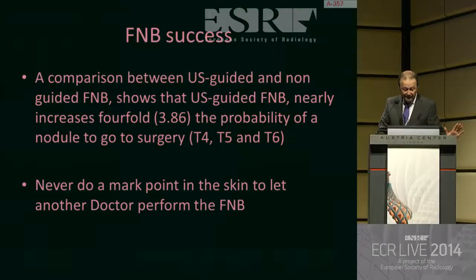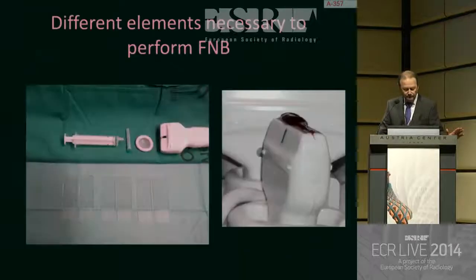We have seen that when the procedures are done by the radiologists, the probability of a nodule going to surgery is multiplied by 4. So it's very important to put the needle in the most suspicious nodule, in the correct part of that nodule: the solid, vascularized, peripheral portion, avoiding cystic spaces. Never do a mark point in the skin to let another doctor perform the FNB.